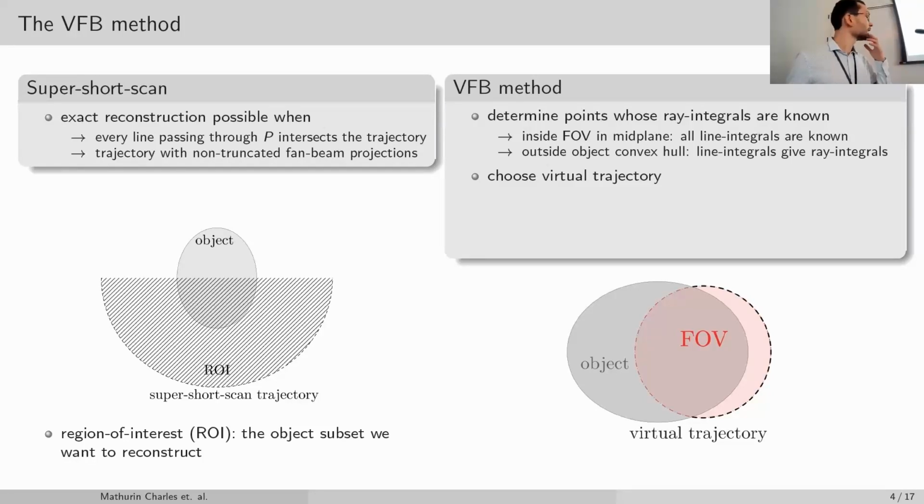Here we have not performed a noise study. We have done it in a paper to be submitted, just for the 2D midplane, and basically the noise properties are similar to the filtered back projection formula. Okay. Thank you very much.